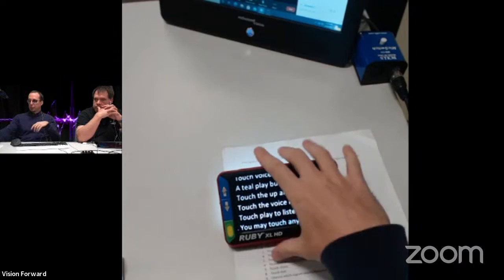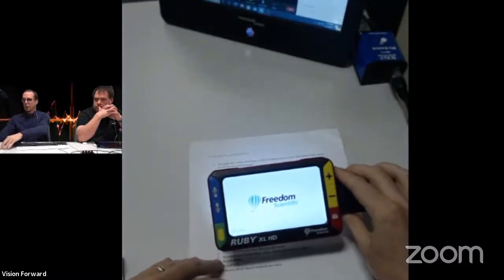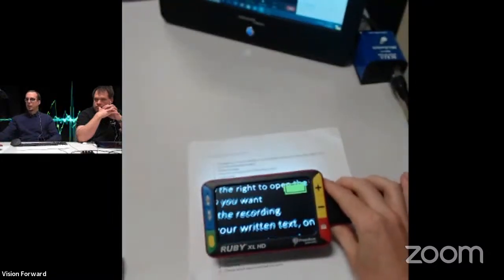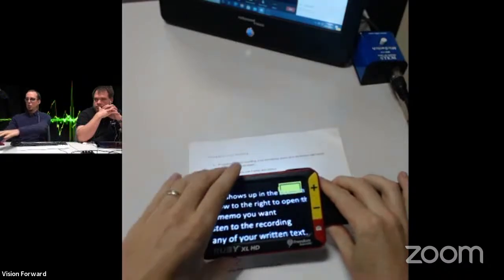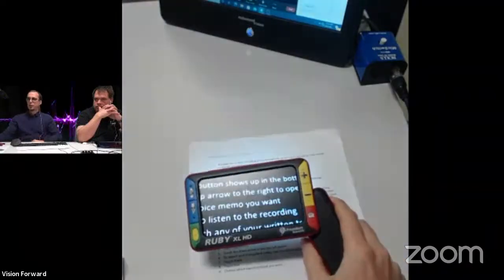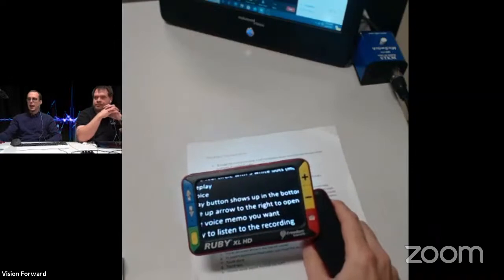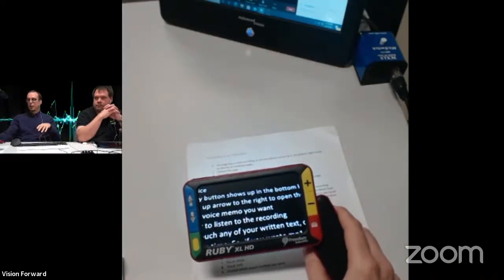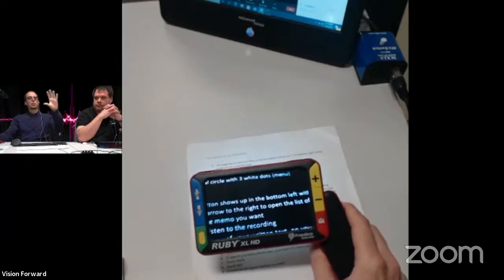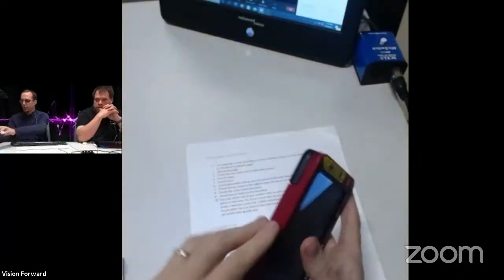Like I say, generally very simple to use, and this one includes a handle, and so you can hold it kind of like a regular handheld optical magnifier. And the handle on this one is actually kind of cool because you can either have it coming out completely horizontally from the screen, or you can actually fold it into this 45-degree position if you find it easier to use like that. And you do kind of need a steady hand to read like this, but some people prefer it like this, and also depending on what you're looking at, if you're trying to look at something on the wall, for example, the handle will be very useful for doing that type of thing.